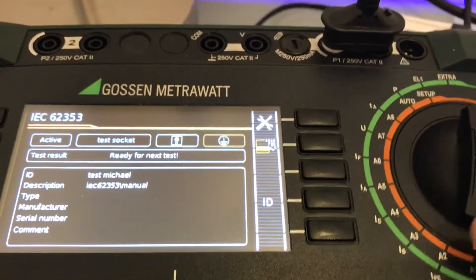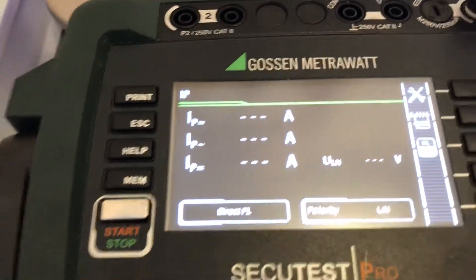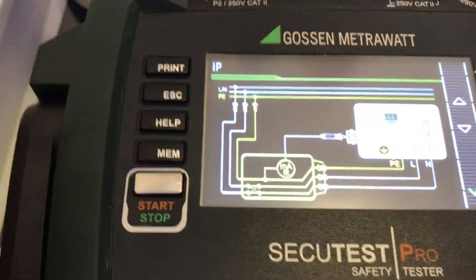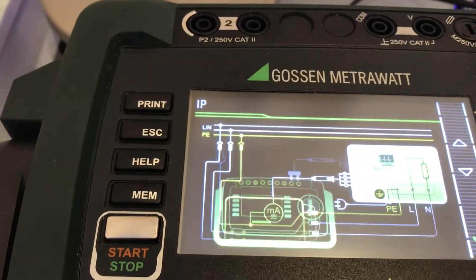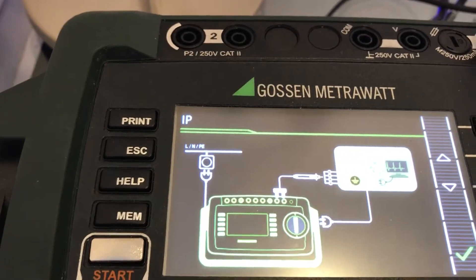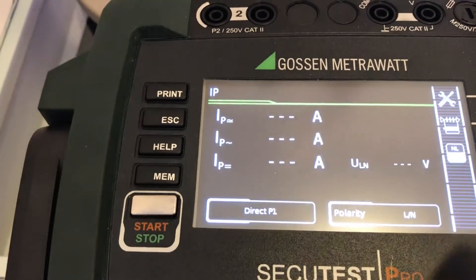The help button will be activated when we go into manual measurement. We can press the help button to see how that measurement is made, or where to put the probe on the device itself, and then we can confirm the same one.